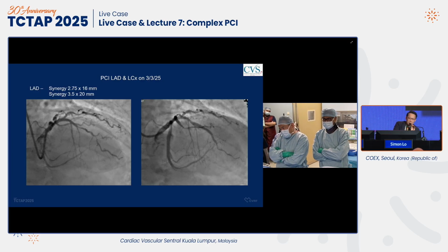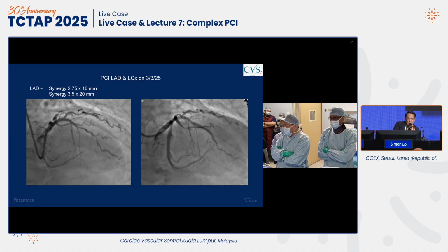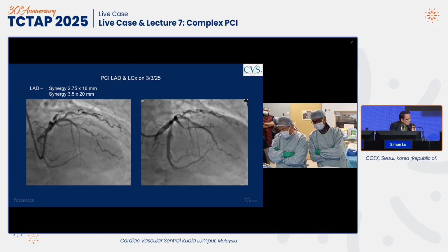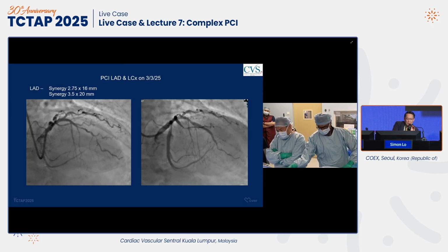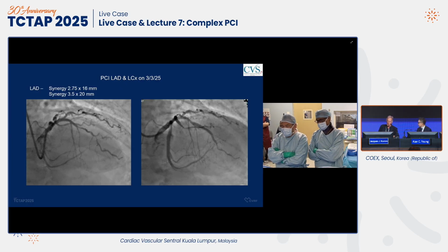But certainly the proximal to mid RCA lesion, if it is very heavily calcified, IVL is a good option. It is a big artery, and I think finally one will have to stent that lesion. The question is how many IVL pulses are we allowed to shoot in this RCA? Maybe you will consider drug-eluting balloons, seeing a relatively young patient with diabetes, and for the peripheral small vessel, a drug-coated balloon might be a solution.